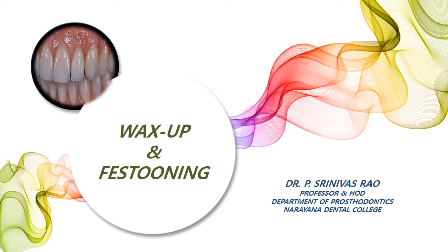The topic is very tiny and small. It is more concerned about the preclinical aspect of prosthodontics, that is the festooning or wax-up procedure of complete denture processes. This particular laboratory technique is performed once we finish the maxillary and mandibular anterior and posterior teeth setting, and the remaining portion between the teeth and denture base is built with wax and carved into a certain configuration to mimic the alveolar process and the gingiva.